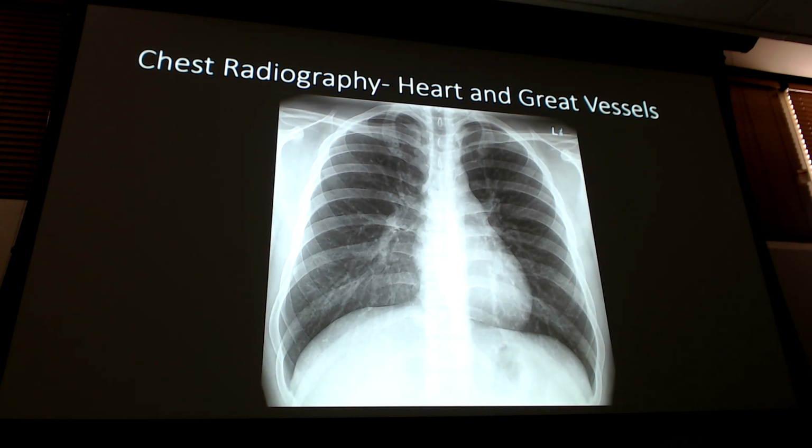Penetration, thank you. You'll run through those in like 15, 30 seconds, just boom, boom, boom, boom. Because once you know what you're supposed to see, it's what you're not supposed to see that pops out at you. Like, I can't see those thoracic vertebrae. That'll pop out at you. So we run through that, so we're good. And that's pretty much as far as we got in evaluating it, and just knowing that it's adequate.